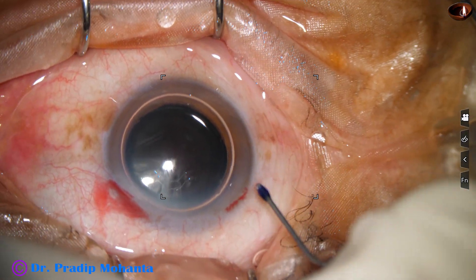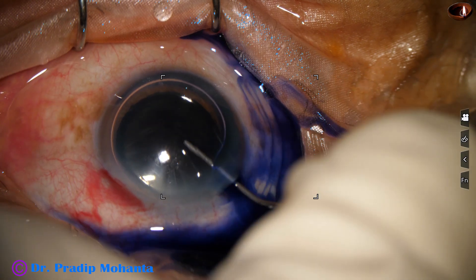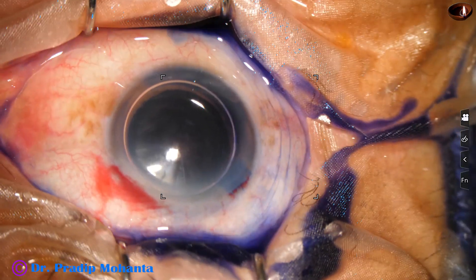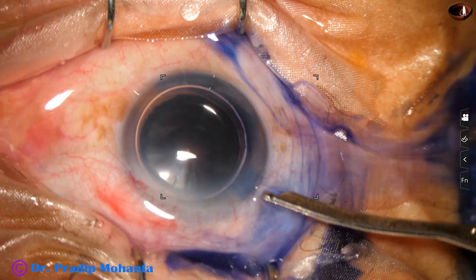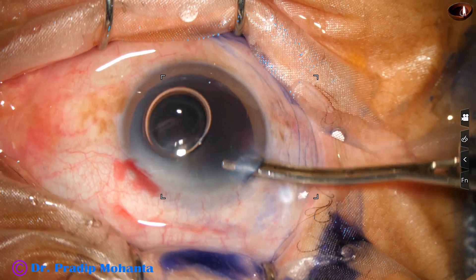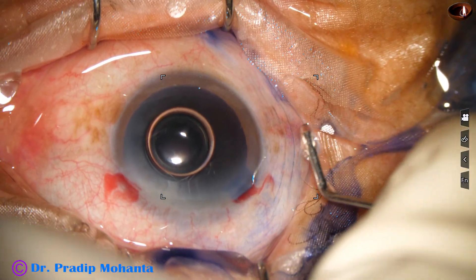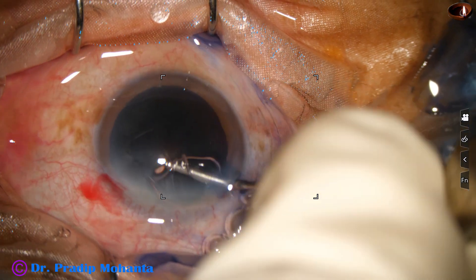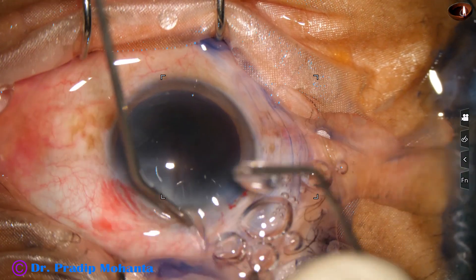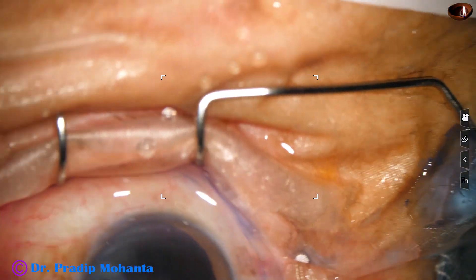Underneath this air bubble, trypan blue dye is applied over the anterior capsule to stain the capsule so that the rhexis can be done easily. This is adrenaline, and now the dye is washed out. 2% hydroxypropylmethylcellulose is injected to fill up the anterior chamber. Methylcellulose is a very good viscoelastic substance and it can protect the corneal endothelium very well.